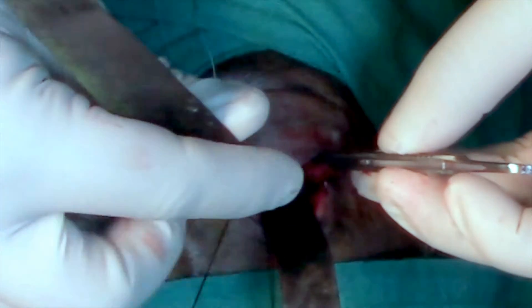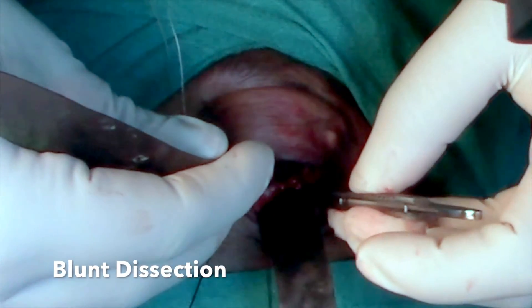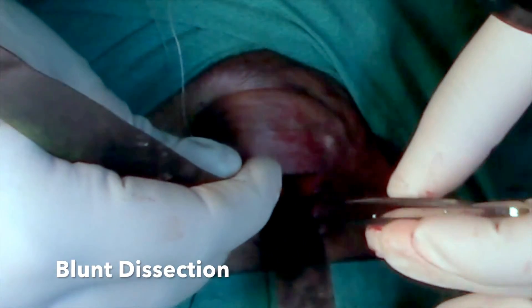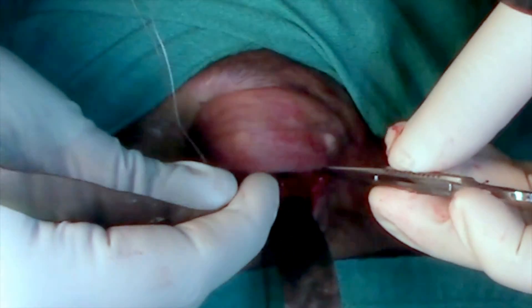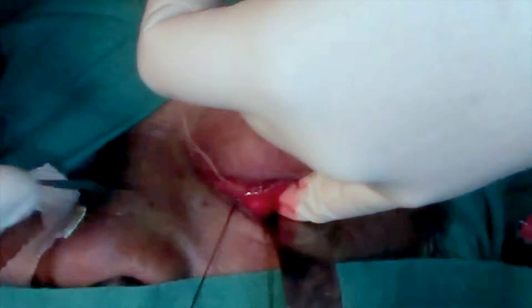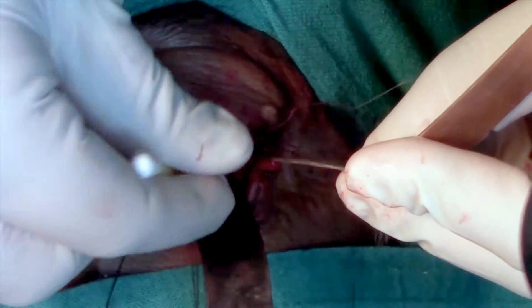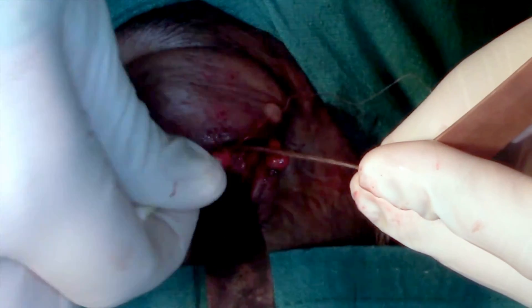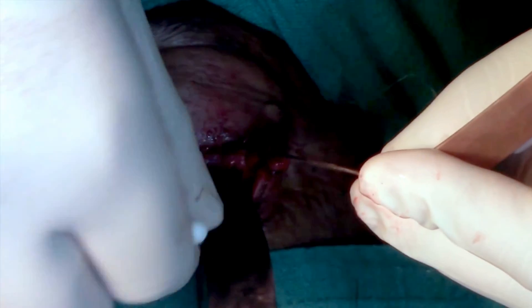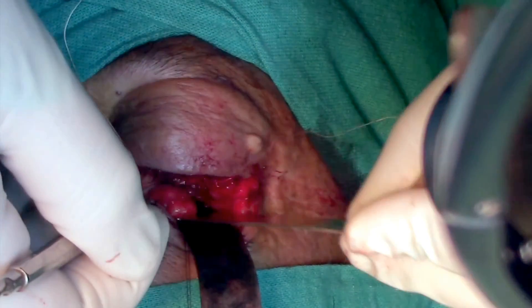Introduce a malleable retractor so that you can visualize and dissect within the orbit. Using a malleable retractor, push away the orbital fat and bluntly dissect within the orbit. With your finger, digitally palpate the tumor. Here the tumor is very anteriorly located and one can visualize the surface of it, which I am now cleaning using a pledget.